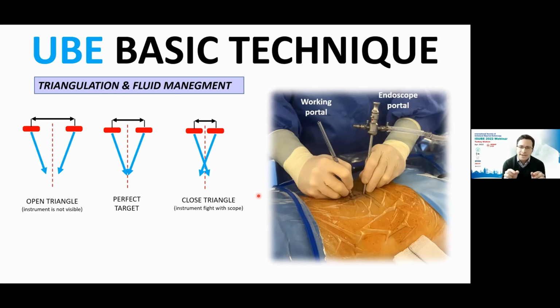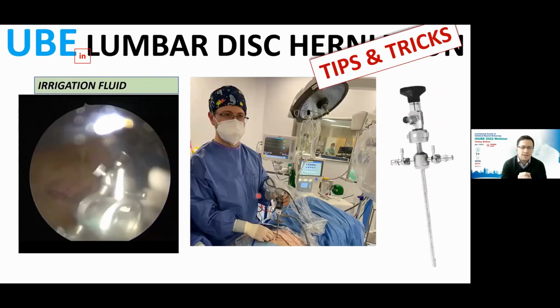But making the incision very close is very, very difficult too, because when you are in the groin, our instruments start to fight each other because we don't have space. So you have to pull back your endoscope and put your cannulas around you. You have to think about this three-dimensional triangulation in your surgery. It takes time, but in 8 or 10 cases, you understand this triangulation.